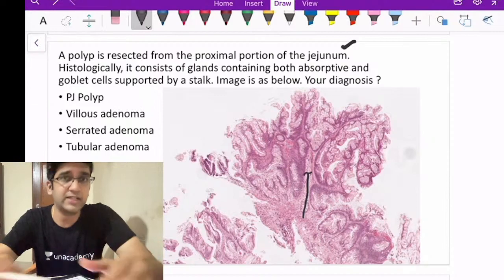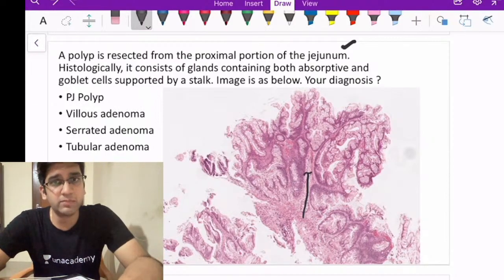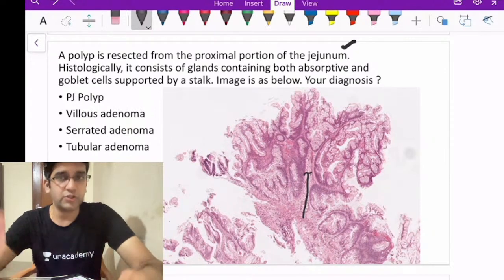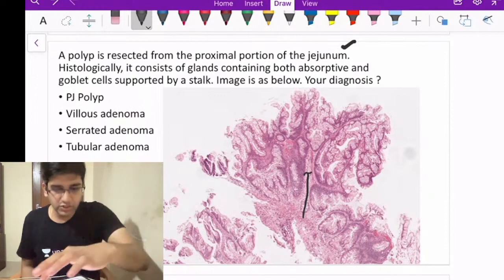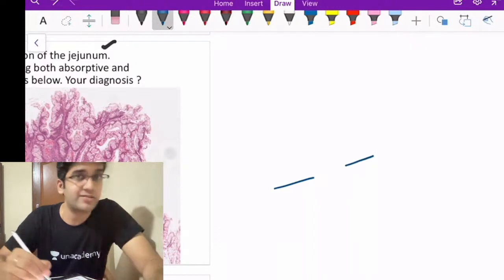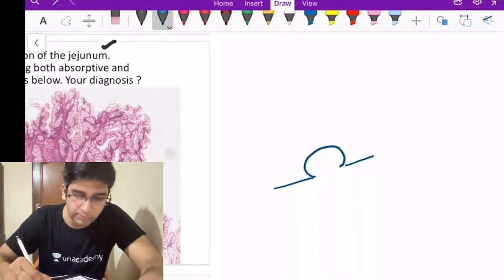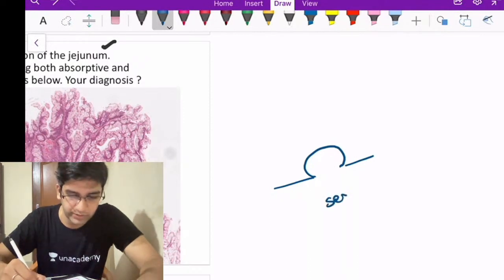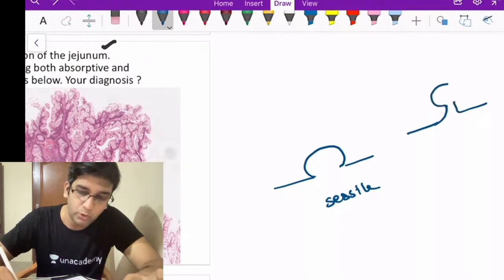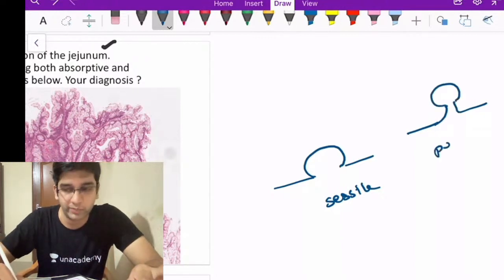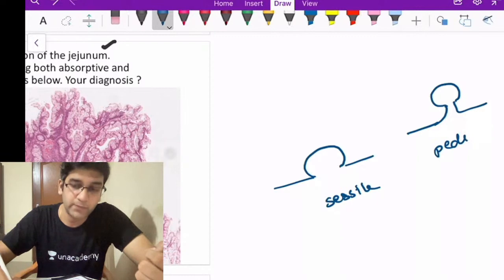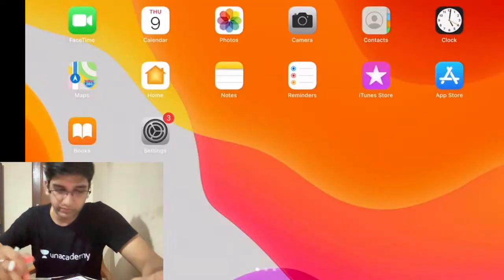The question reads that histologically it consists of glands containing both absorptive and goblet cells supported by a stalk. When you have a stalk — let's understand sessile versus pedunculated polyps. A polyp without a stalk is called a sessile polyp. When I have a stalk with a polyp on top, it's a pedunculated polyp. The mistake of calling this stalk a Peutz-Jeghers finding might be wrong.